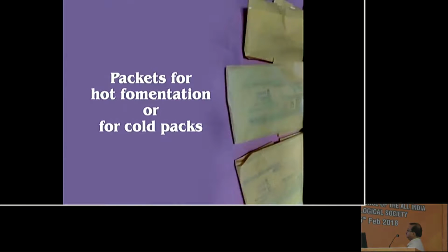Silicon bits from encircling band remnants, buckle bits or old silicon phaco tubings can be cut and packed in microwave compatible wax or oil paper. This paper may be obtained from the back of eye drapes. These can be heated in the microwave for about 30 to 45 seconds.